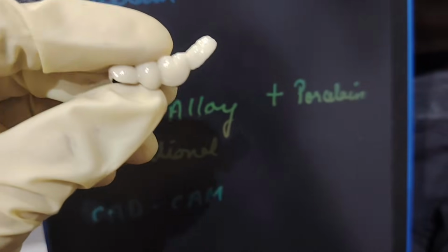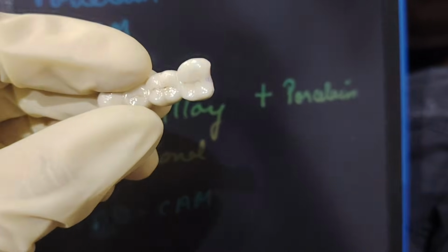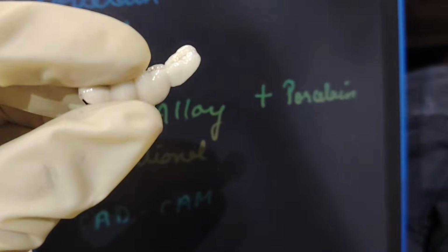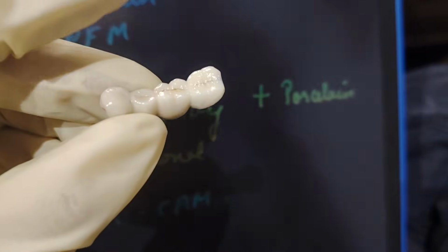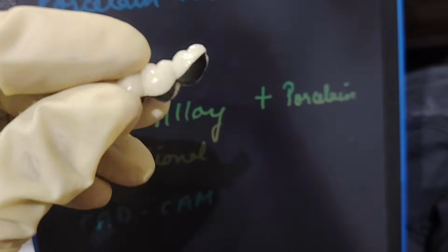It has many advantages, but a few disadvantages as well. It cannot be used on very short crowns or when the vertical distance is decreased, because it requires a lot of preparation on the occlusal surface.